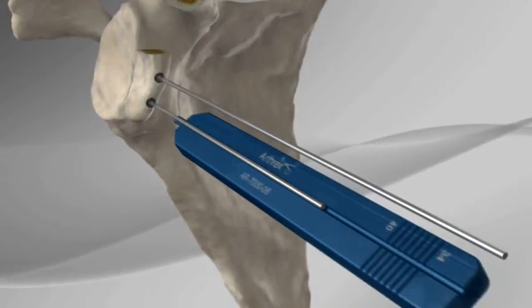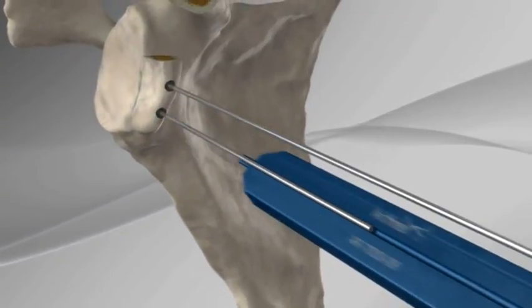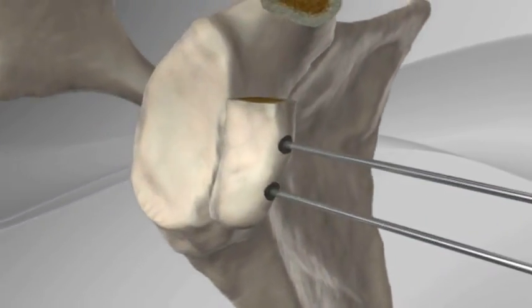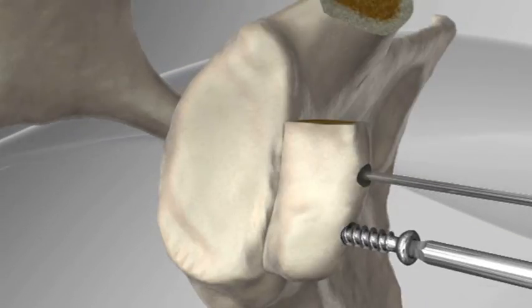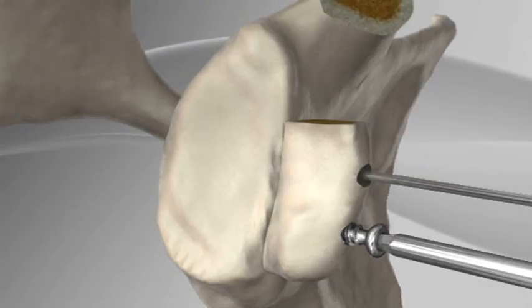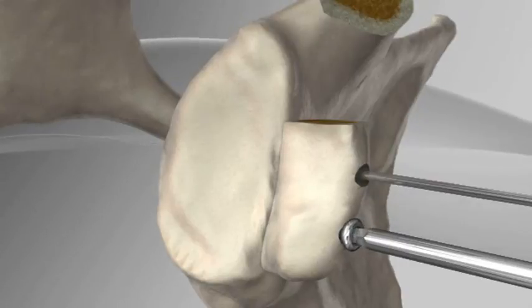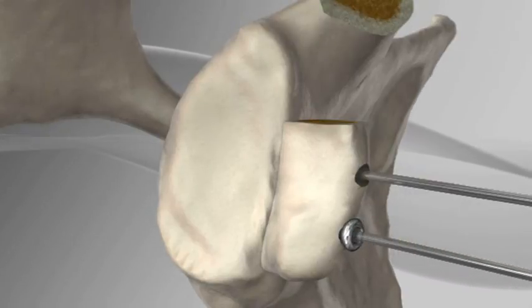A depth gauge is used to determine the length of the screws that will secure the bone block. The screws are placed over the guide wires and tightened down, fixing the bone block to the anterior glenoid and preventing further dislocations.